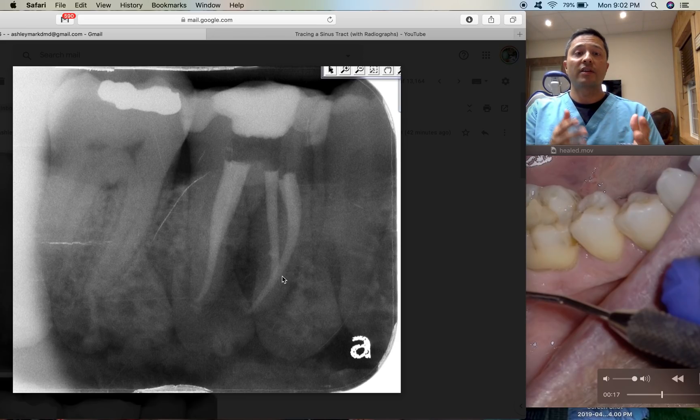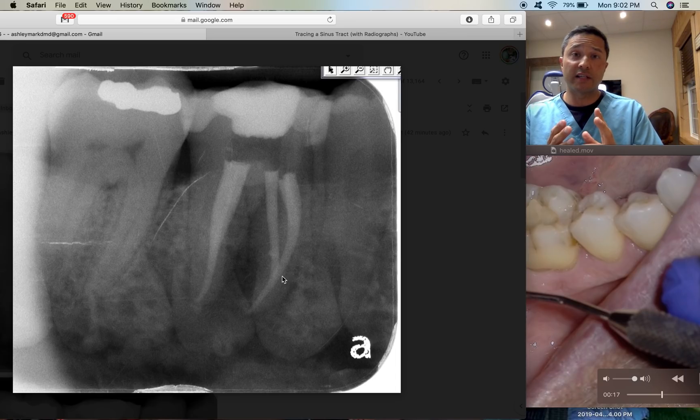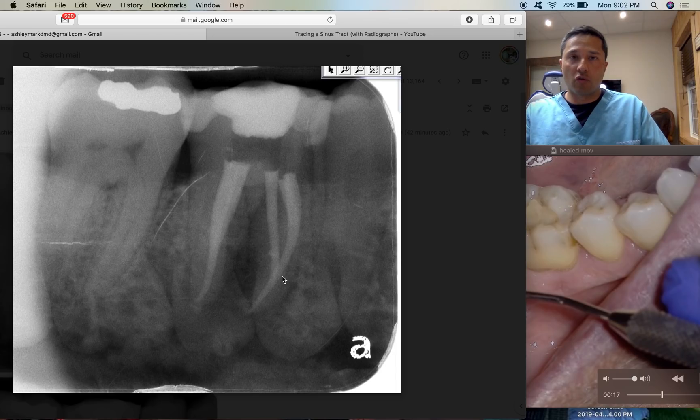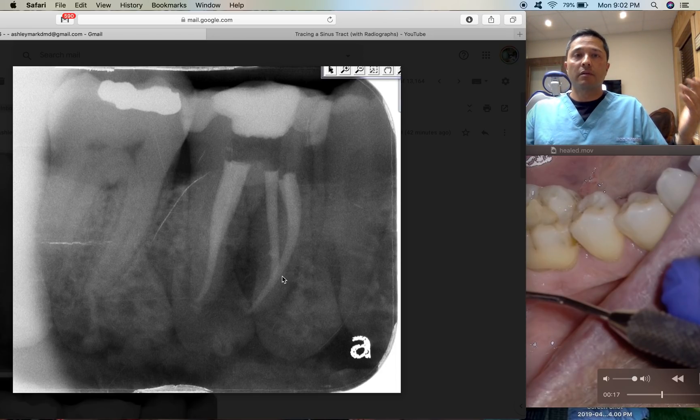The shift shot can tell us so many details about which canal is which, and if your file is long in one canal, doing a shift shot and practicing that can help us during a root canal — so you don't get more gray hairs. Working length radiographs can be super frustrating, so taking the time to learn the SLOB rule really well can be very helpful.